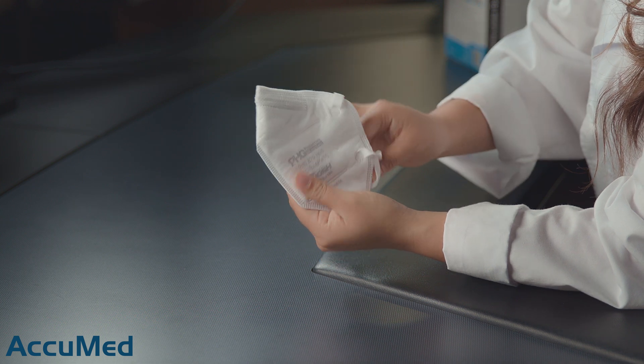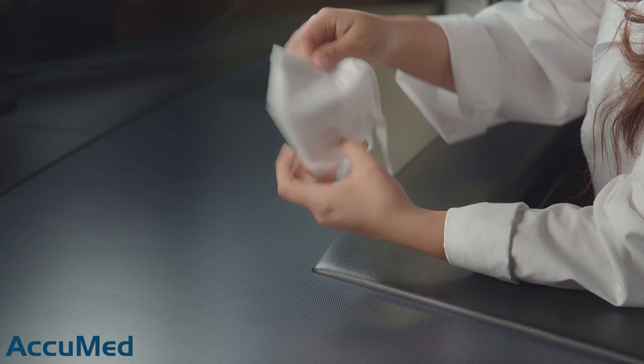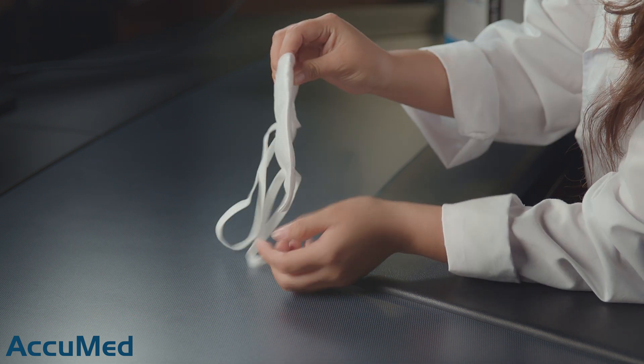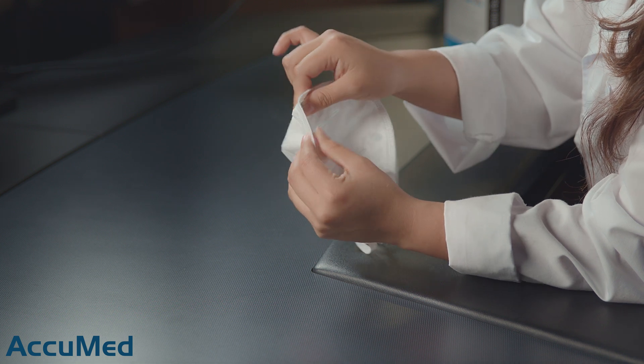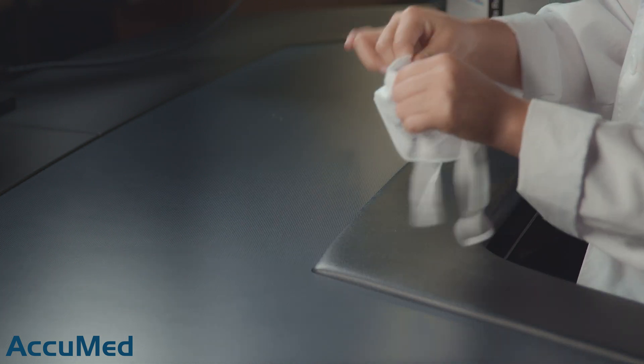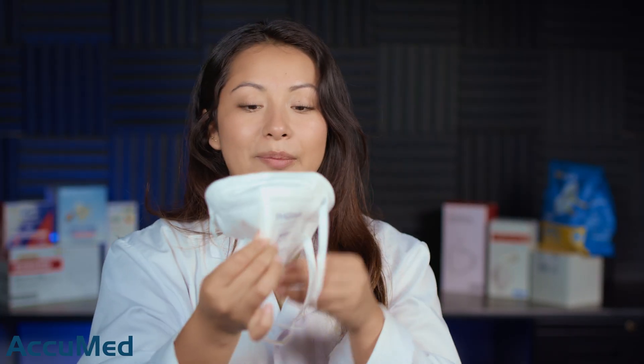These are a ripped material headband, which personally are not my favorite — I do feel like these are less comfortable. It also has a nose foam, and the nose wire is actually extremely flimsy. Not the best nose wire. I'm going to flatten out the nose wires since these are a bifold style.